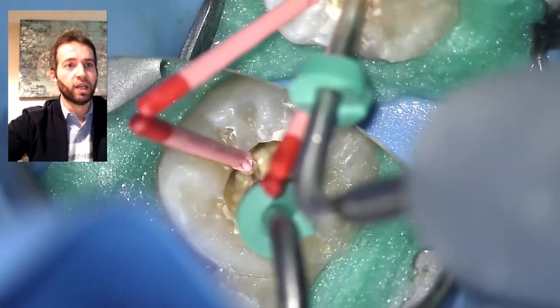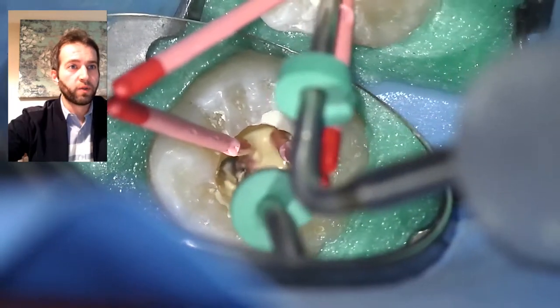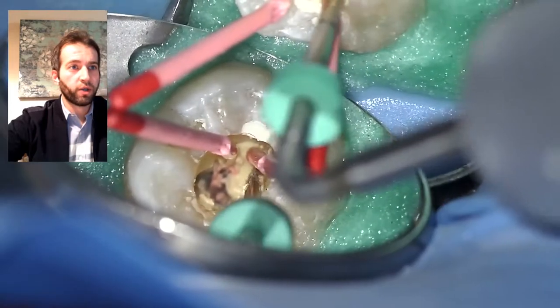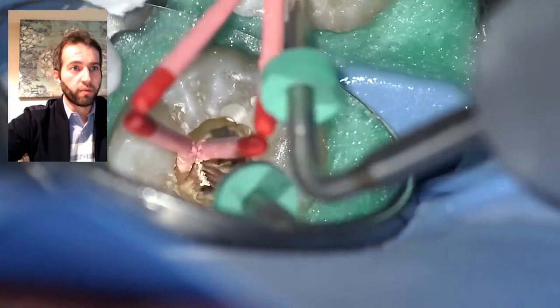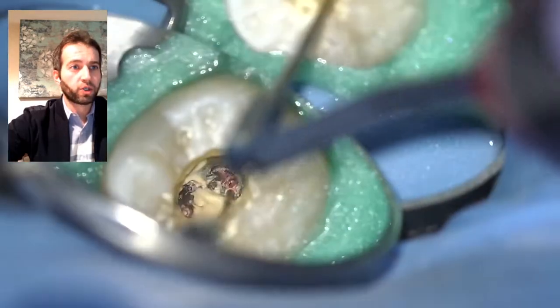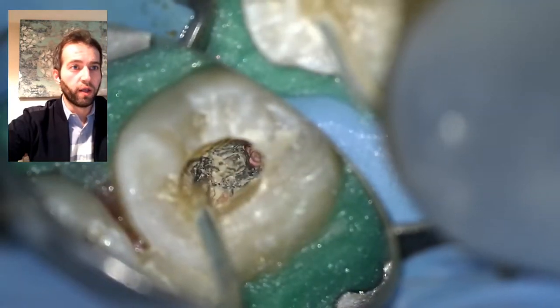This is a System B heated tip — it's an electrical heater. I remove the coronal and middle part of the gutta-percha to a pre-measured length, as you can see with the stopper. Once I reach that pre-measured point, I remove that piece and condense it with pluggers. I do the same on the distal, remove both seared-off cones, and then the molten gutta-percha is condensed with pluggers of different sizes according to the case and depth — compacting very well at the very end.